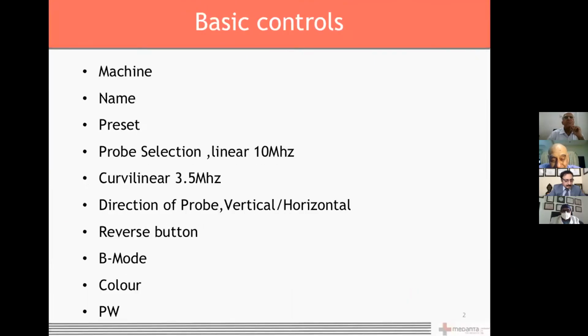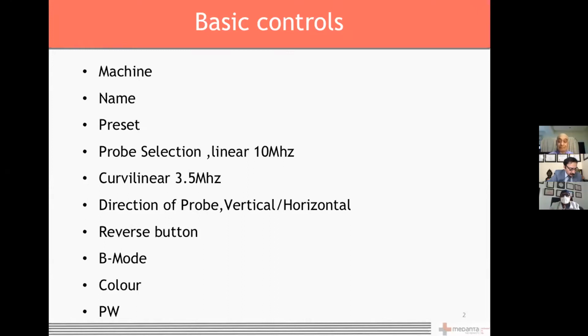All you have to know is about the anatomy and the difference between the arterial and the venous system, their characteristics. We all work on a duplex scan, so we should know our machine. There are n number of machines available. The basics are the same, but the buttons and little differences are definitely there. So you should know your machine before you go for the scan.